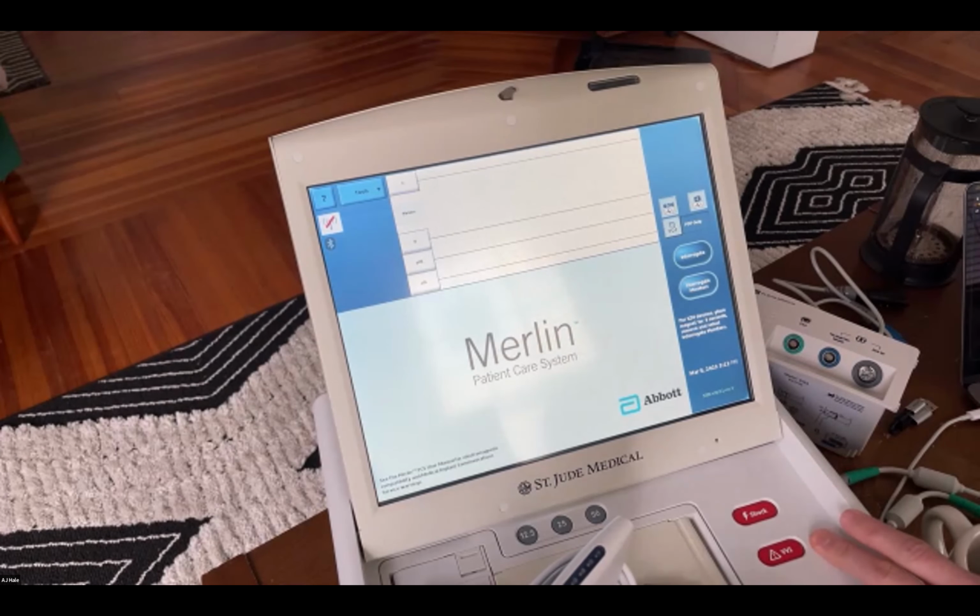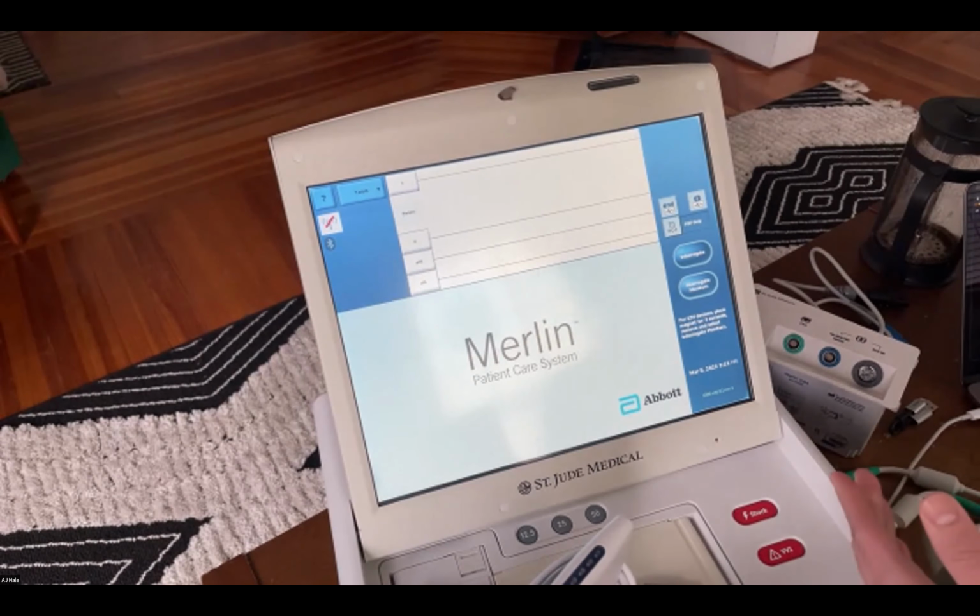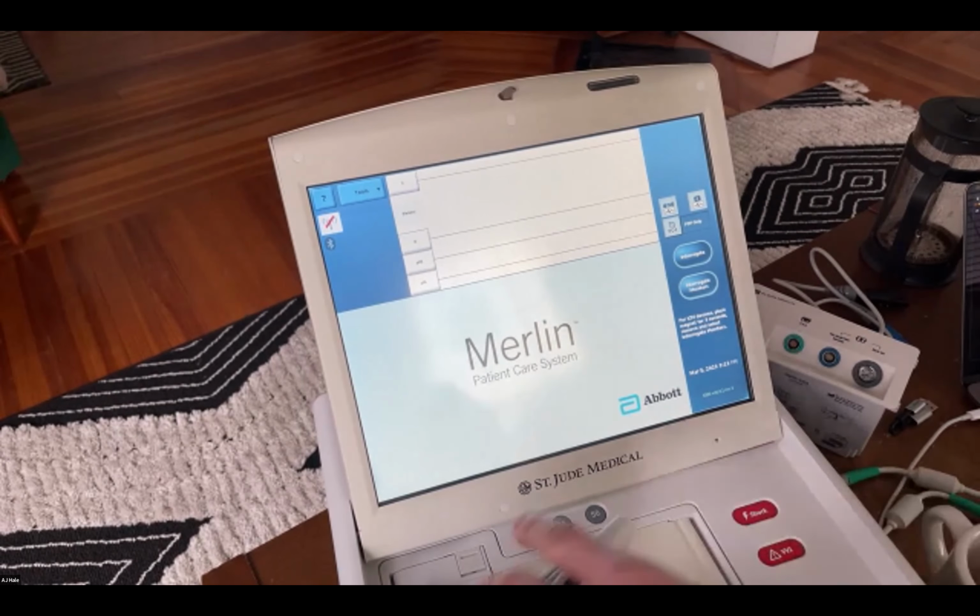Just keep in mind that it is unipolar. So it's going to use unipolar pacing. If the device is outside of the body and you hit this button, it's no longer going to be able to capture unless it's touching something metal that's touching the body or soaked in a wet rag, possibly. Because unipolar, you need to have a closed circuit.